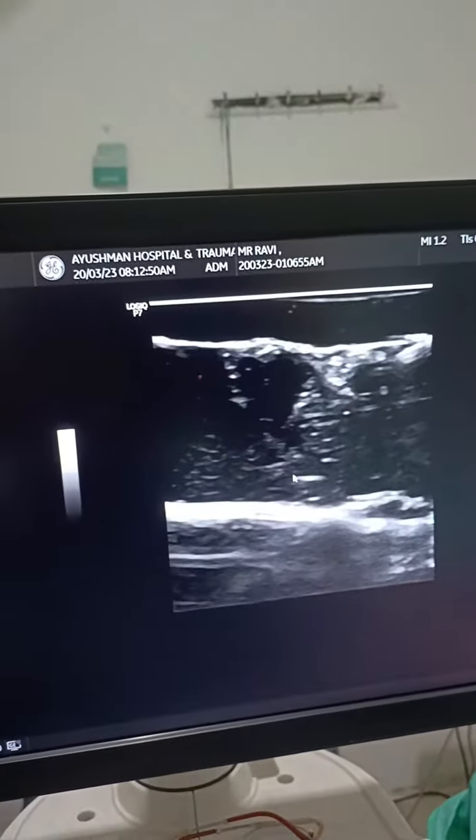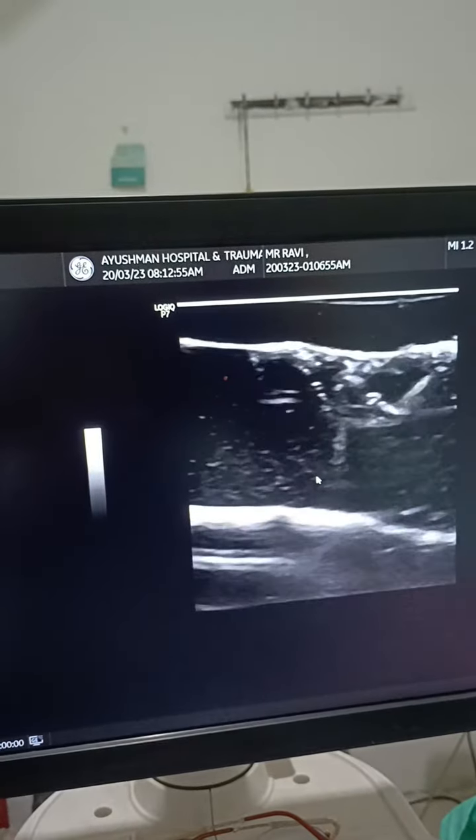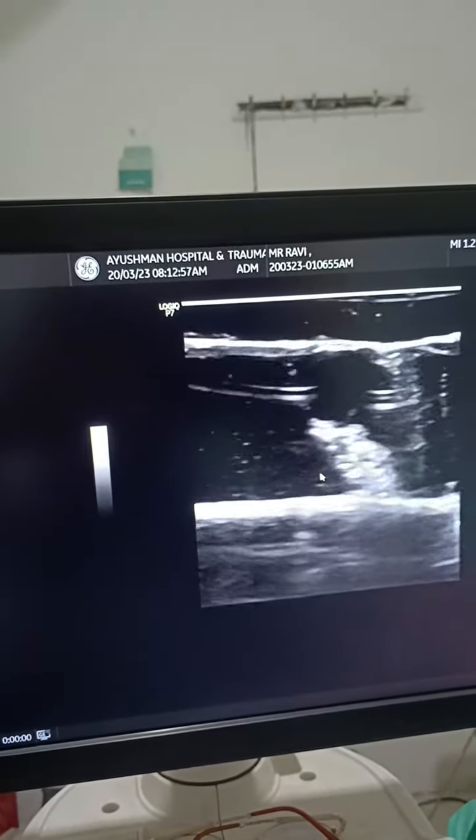This is our brachial plexus. And we have to deposit the anesthetic agent here. If we have to go towards the base of the artery — let's see where is the artery. This is the artery.